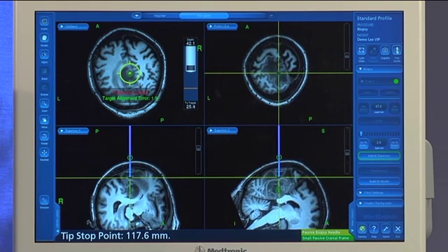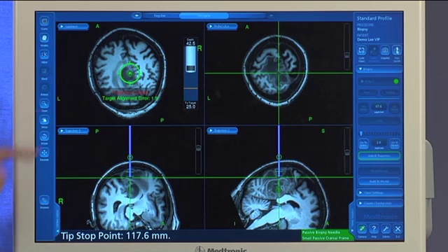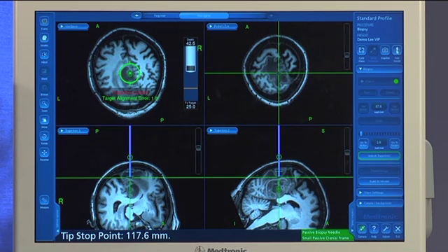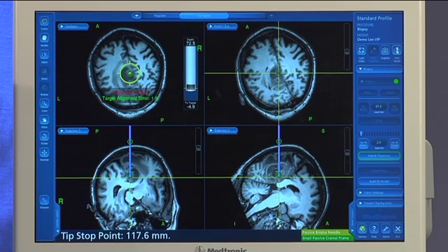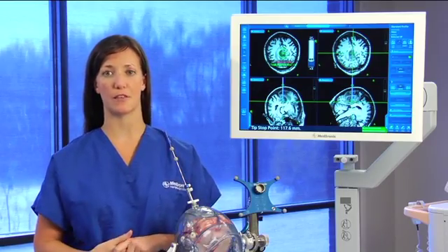The nice thing about our software is that it gives you visualization in all planes. These two blue lines here indicate exactly where the cut window is versus the tip. Additionally, that gray box indicates your cut window with the yellow line indicating where the target is that you've identified previously. As I scroll through and pass the needle, after you've placed your biopsy needle, you can go ahead and aspirate and send the sample off to pathology.